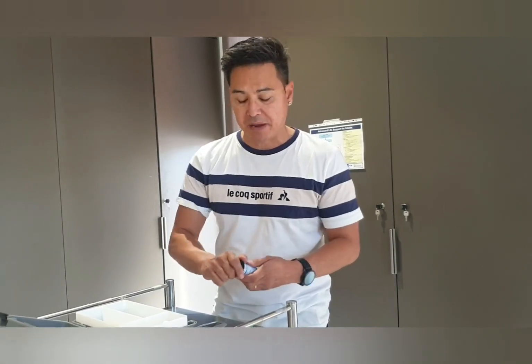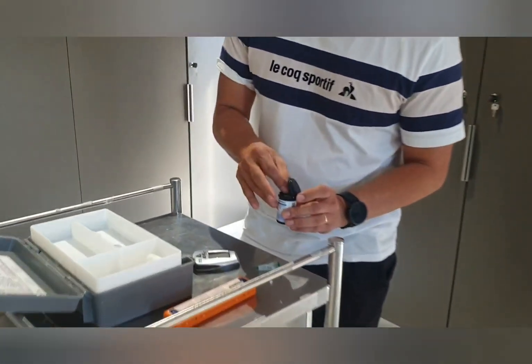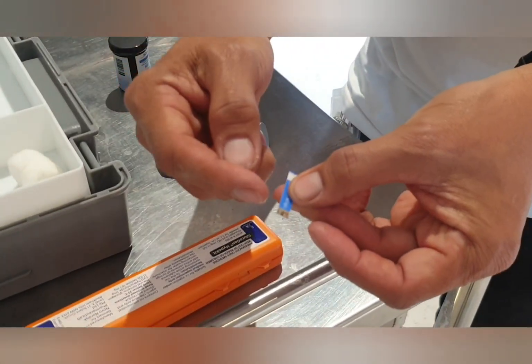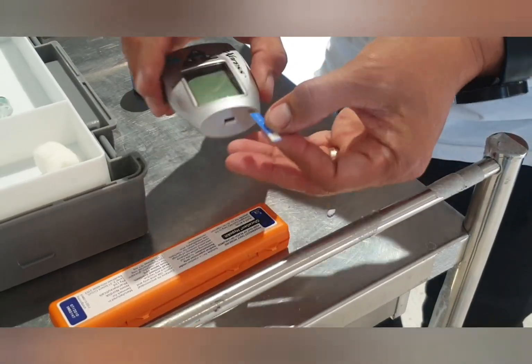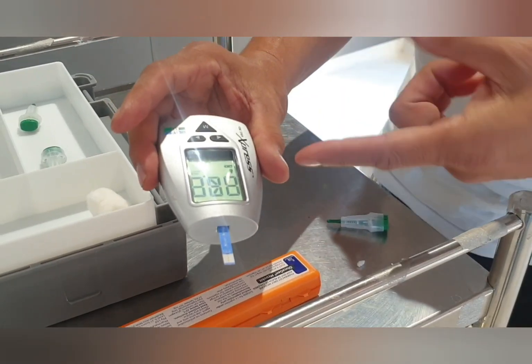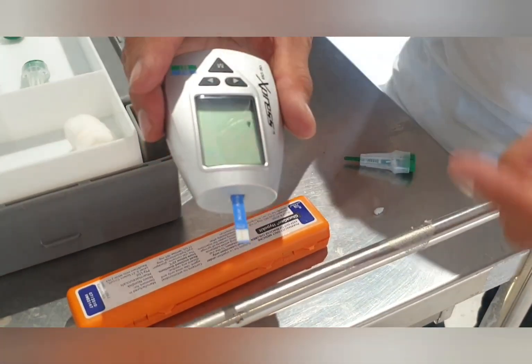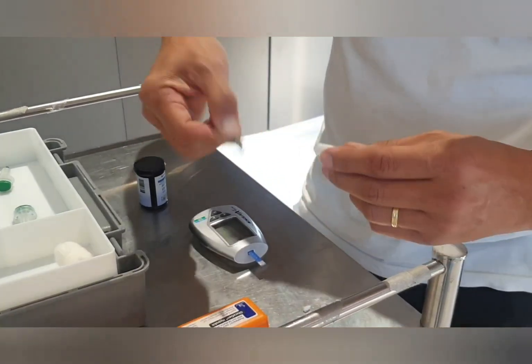What you need to do is take a strip out — I'll get a close-up of me taking the strip out, because every strip is pretty much the same. The strips have a little electronic contact end that goes into the machine, and there's a little area where you soak the blood up. The machine gets activated by just putting the strip in, and once it's in far enough, you'll see a little droplet icon asking you for a sample of blood.